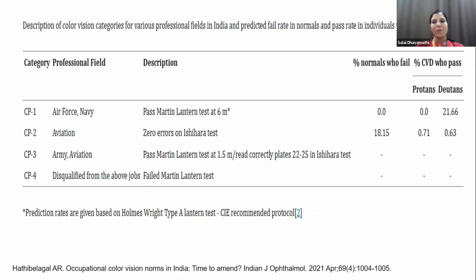Sometimes lighting is also important. Glare. If there is a glare, then it is difficult. Okay, they test binocularly. It depends. So some errors they make. Thank you so much, ma'am. That is one of the important points which we have to advise students to look for.